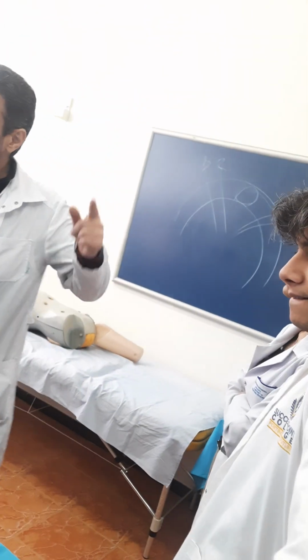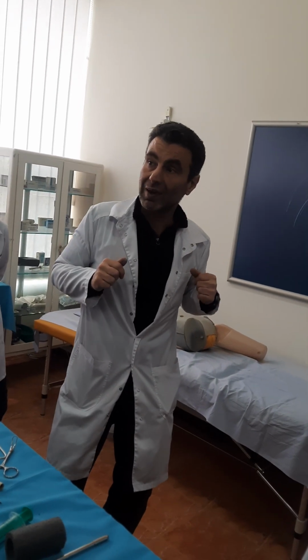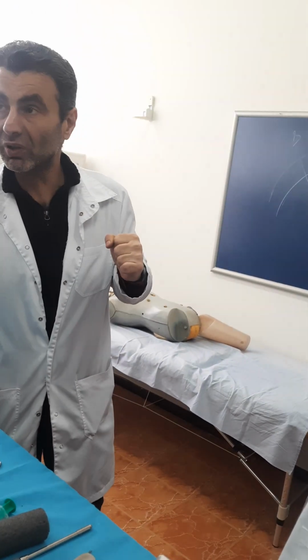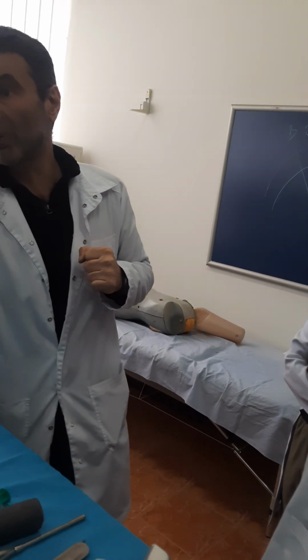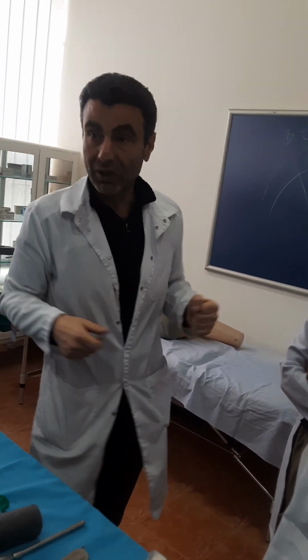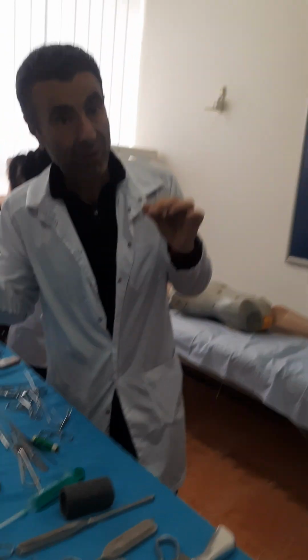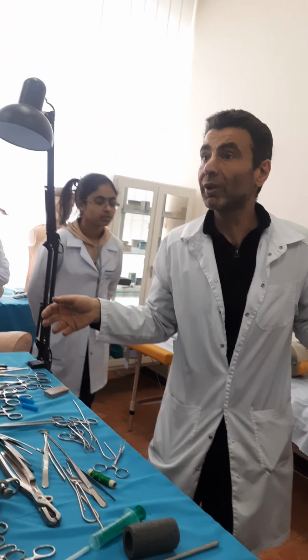Why? Because occlusional clamps we apply on the non-removable part of the organ. Crushing ones, vice versa. Crushing has one important meaning. It crushes all the vessels and stops all the bleeding in that place before I ligate and before I suture. Occlusional clamps close only the lumen to prevent formation of peritonitis. Otherwise, feces will flow inside the peritoneal cavity and will kill us.